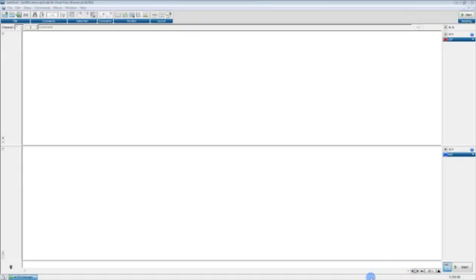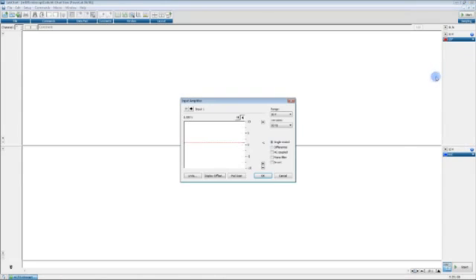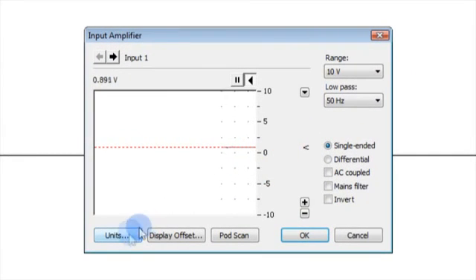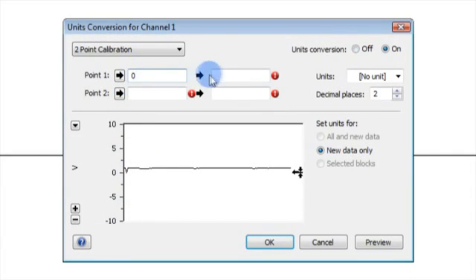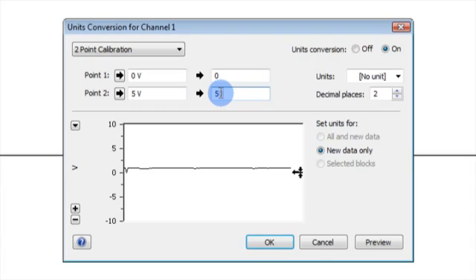Applying units conversion. To apply units conversion to the laser Doppler flow signal, firstly, open the input amplifier dialog for the laser Doppler flow channel in LabChart channel calculations. Click the units button to open the units conversion dialog and set a two-point calibration where 0 mV is equal to 0 perfusion units and 5000 mV is equal to 5000 perfusion units.